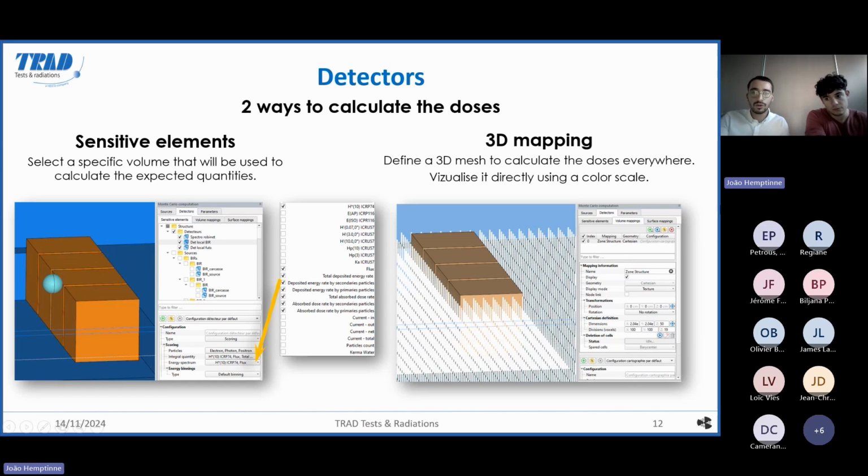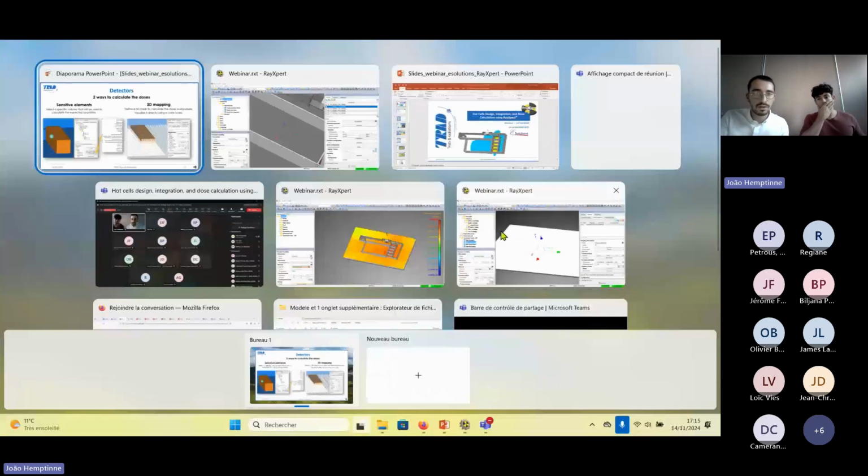The second way, if you want a more general calculation, you can do it over your whole model. So you create a 3D mesh, which you can see here, and I will let Leo present it later. You have a 3D mesh, and you can then create a 3D mapping with a color map that we just saw earlier. So I will just let Leo speak some words on this.